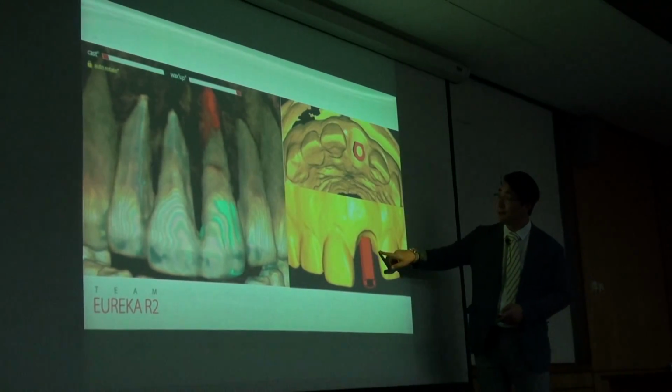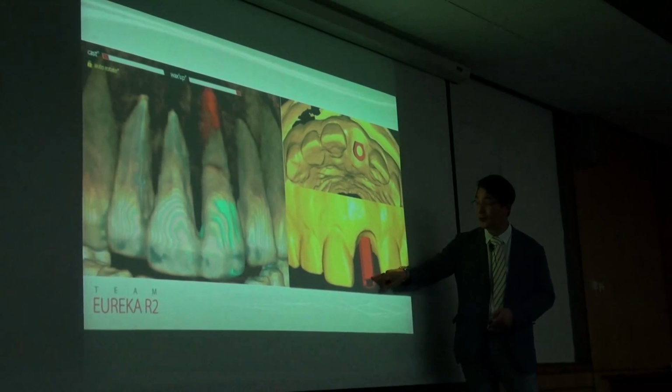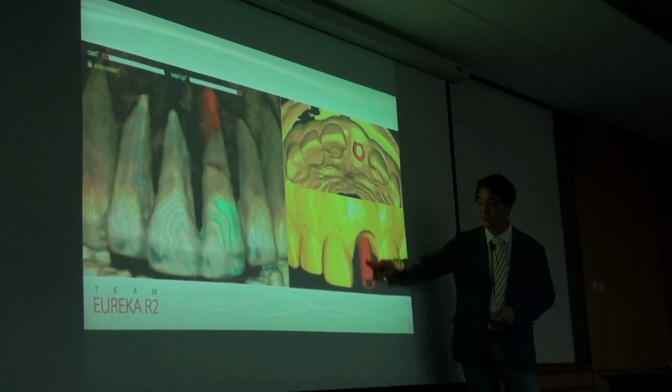So based upon this data, we can make the stent. It's a kind of code, digital code.